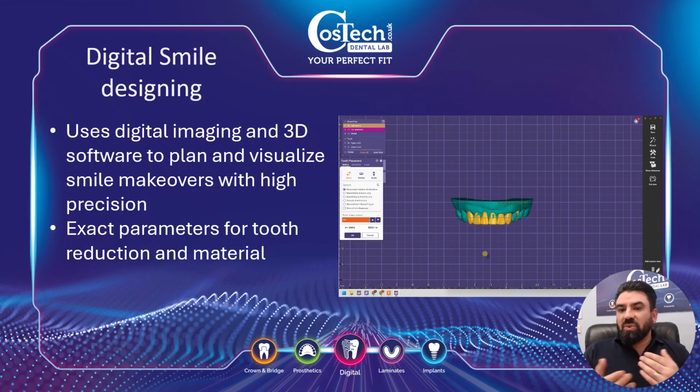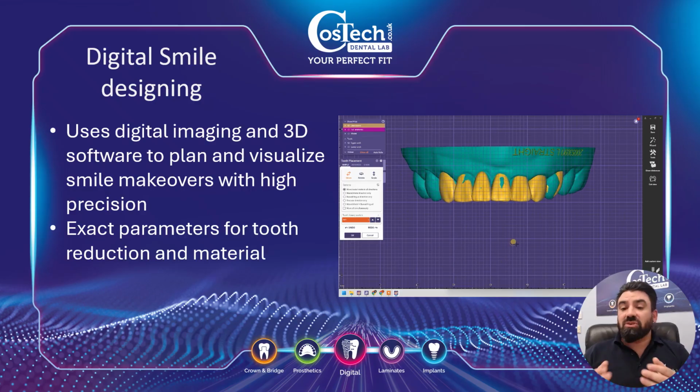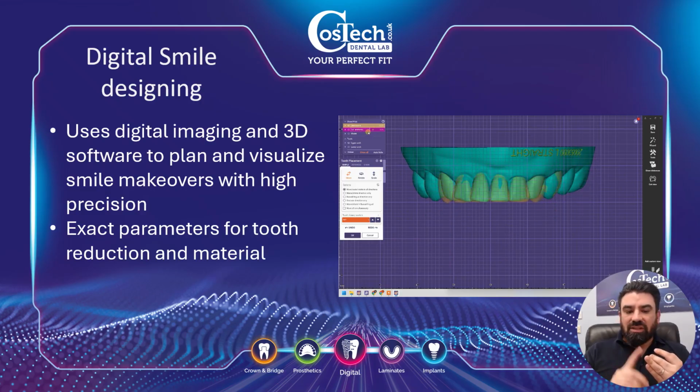So with this, we can actually look at how to achieve what the patient wants, which majoritively is the aesthetics, but making sure that the actual bite isn't going to compromise anything, and also it's not going to compromise their bite as a whole.